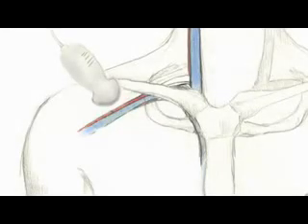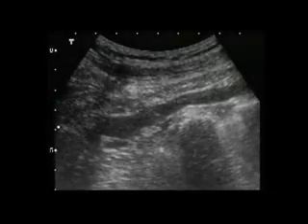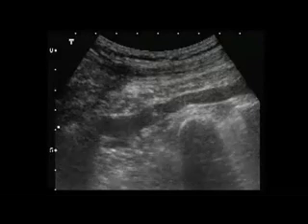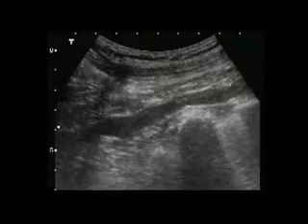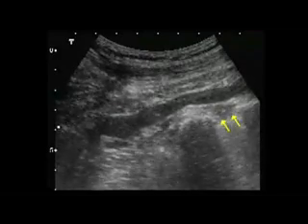The traditional approach to the subclavian vein is difficult using ultrasound guidance because the proximal portion of the vessel is directly beneath the clavicle. However, the subclavian vein can be cannulated more distally using ultrasound guidance with a longitudinal approach. The subclavian vein and artery are first identified at about the midpoint of the clavicle, with the probe in a transverse plane, and the marker dot aimed toward the patient's head. Once the vein is identified, the probe is turned 90 degrees with the marker dot toward the patient's right side. The needle is then advanced under direct visualization to ensure that the needle tip is not inadvertently advanced too deeply. The pleural interface can be seen just deep to the subclavian vessels.